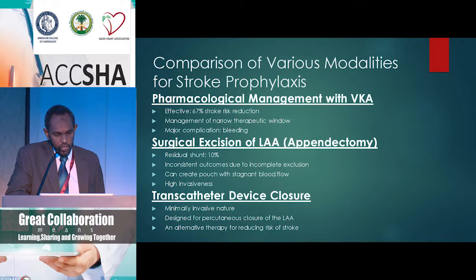Surgical excision of the left atrial appendage, of course, is invasive and is only done in patients who are actually undergoing surgery for another reason. And there is some recurrence. There's residual shunt in 10%, so it's not perfect. So a transcatheter device closure does have a place.